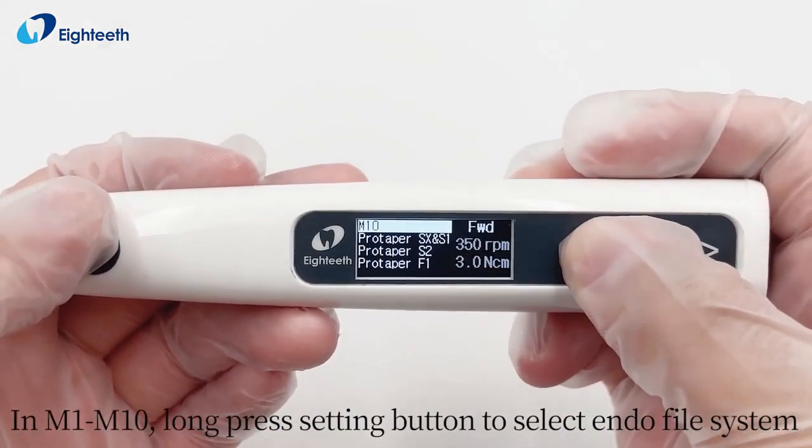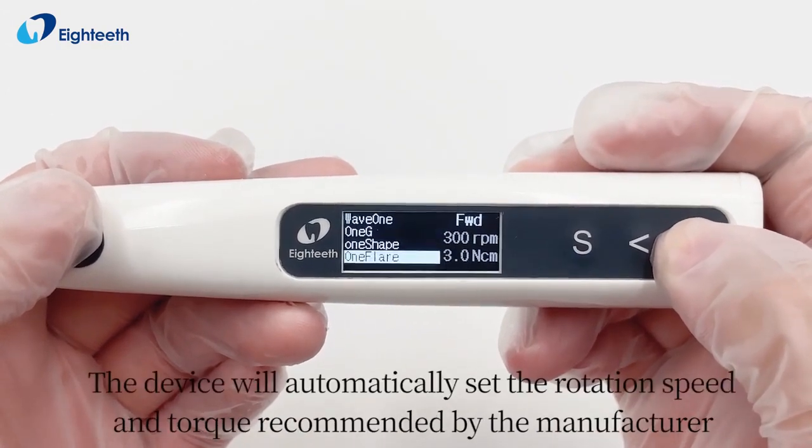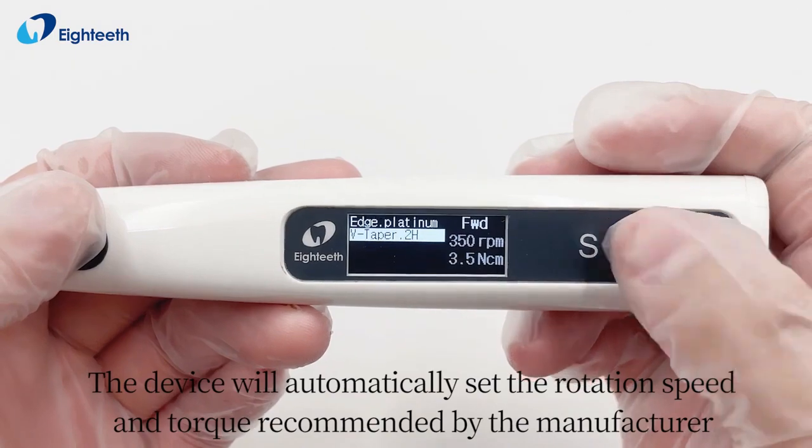In M1 through M10, long press the setting button to select the endo file system. The device will automatically set the rotation speed and torque recommended by the manufacturer.